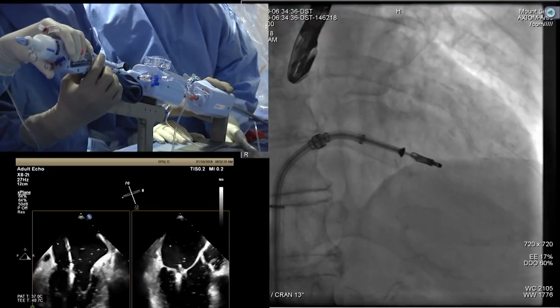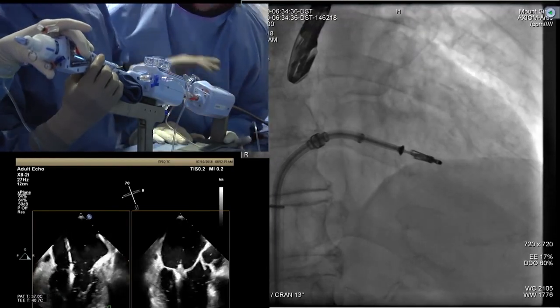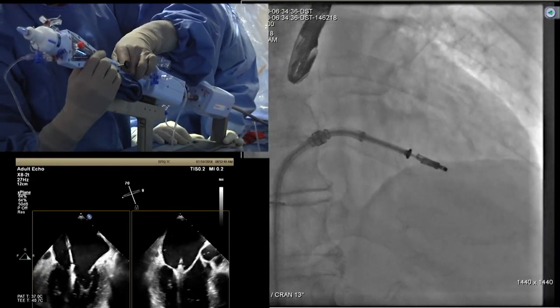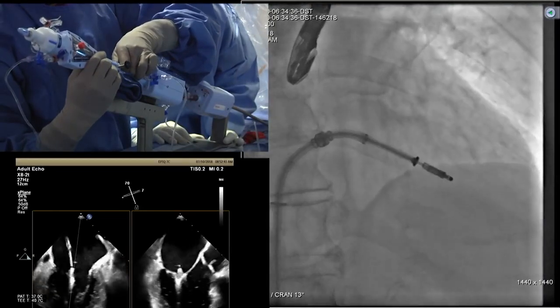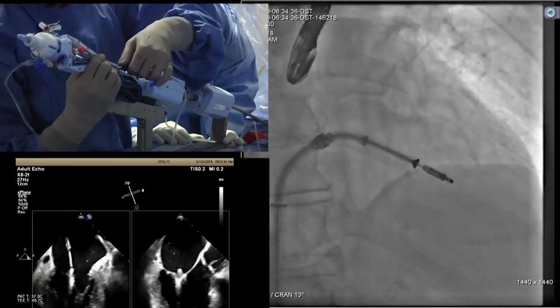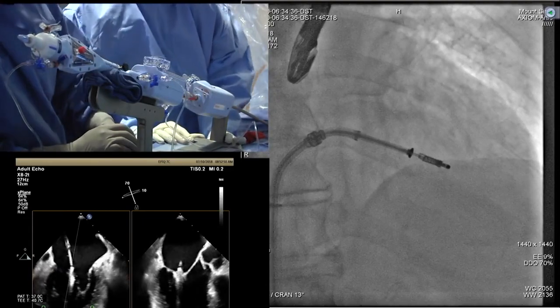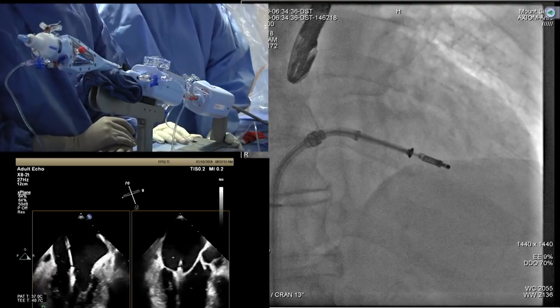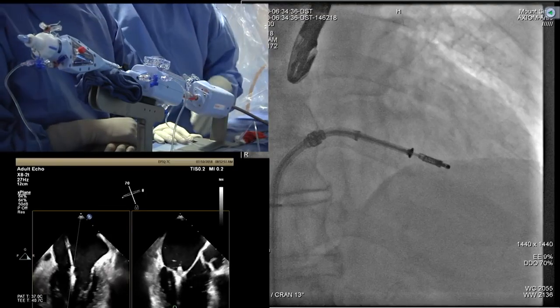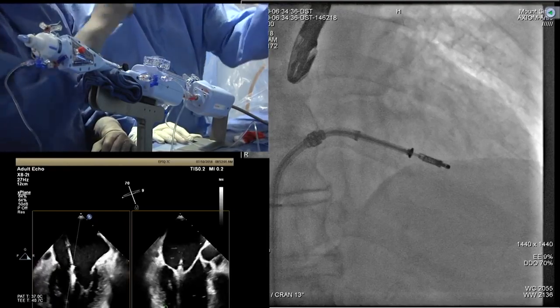Okay, now you have to assess. Undo the tension. What we are doing is I'm going to go in a little bit. Your DC handle, go in a little bit. Nice. And then secure it and hold it. So you have to look for the leaflet attachment. That's the term used. Now Gila will check: did we get enough of the leaflet inside the clip? And also you can see on fluoro as well, the clip has not rotated. Show the fluoro.